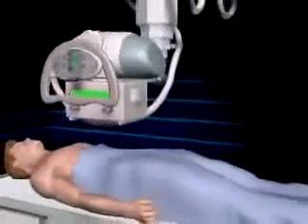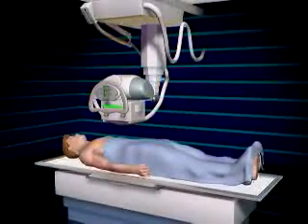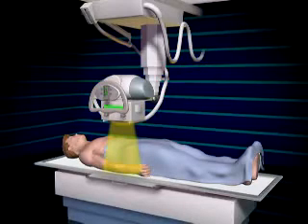During an X-ray, a radiographic film is placed behind the patient, and the patient is placed between the film and the X-ray machine. The X-ray machine then focuses the energy beam at the specific area of the patient's body.